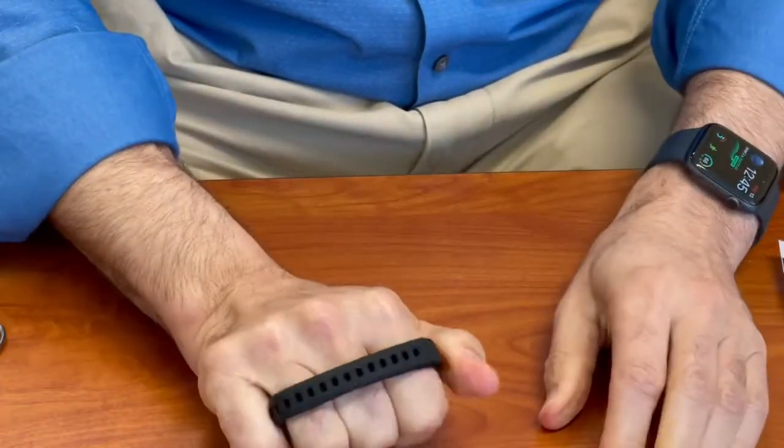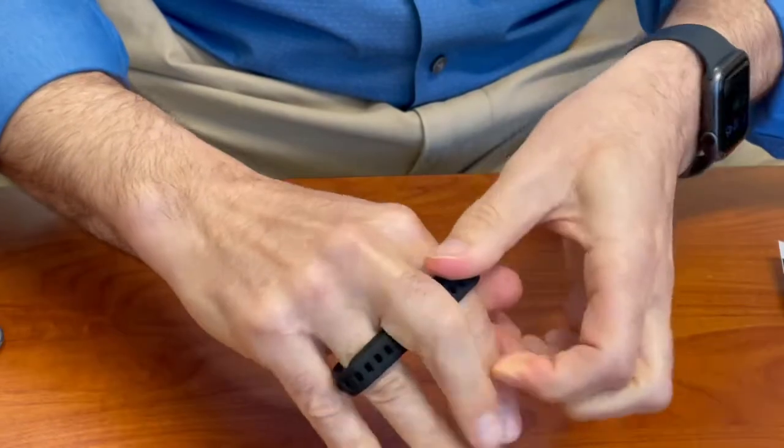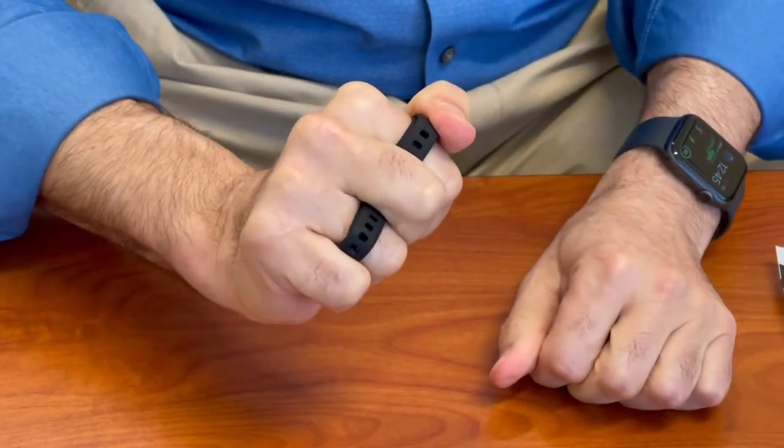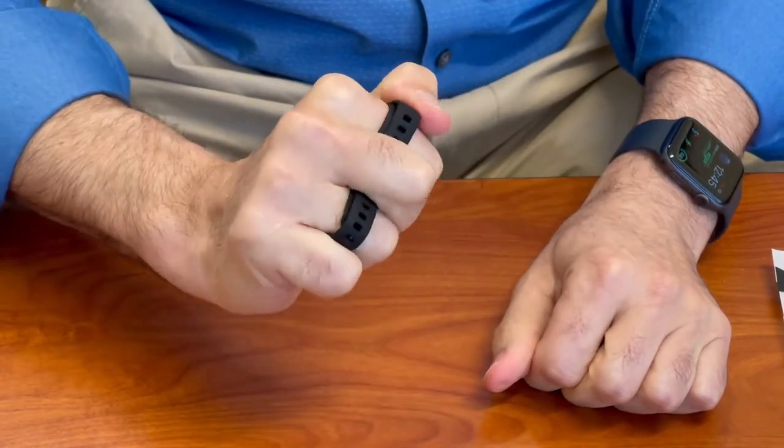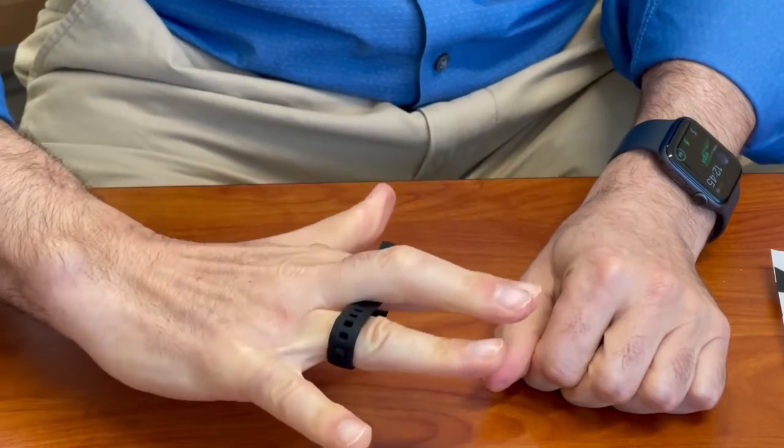The splint goes back on the hand for sizing, put the involved finger into relative extension, take the patient through a couple of cycles of range of motion, and that's the application of the hook splint.